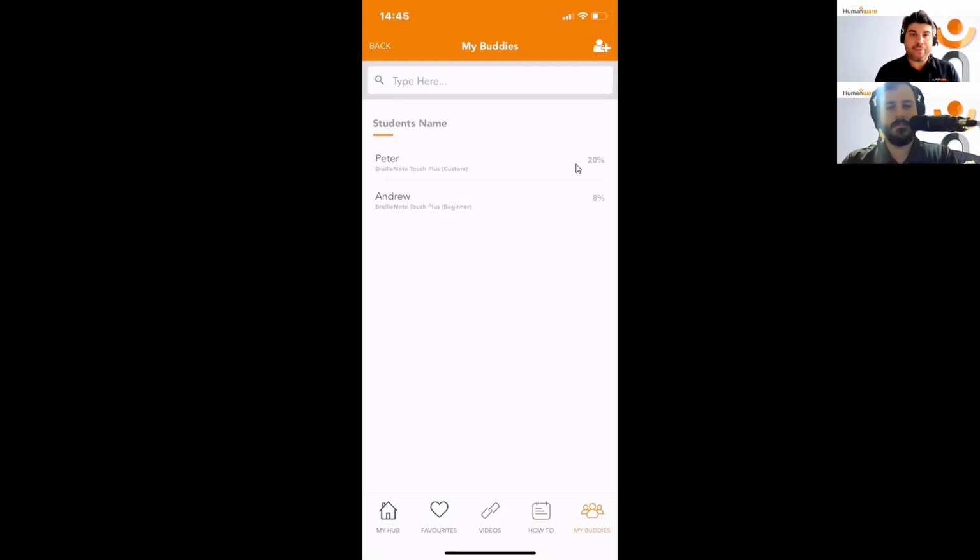And that's it. That sort of finishes the webinar and the learning objectives of today's webinar. I'm going to open the floor to some questions, but before I do, I want to disclose something exciting that I know that many of you have been waiting for. I'm just going to stop my screen here and share a different screen.